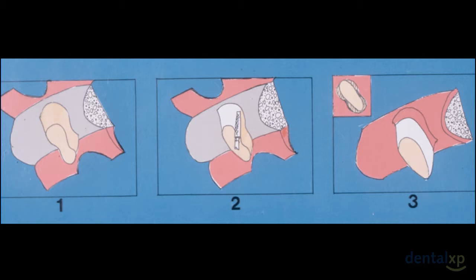When you look at the upper left picture, the dotted areas, the very light gray areas, are the areas where we would remove surface, and the real black area is the area that we would try to leave alone. Again, the goal is to shape line angles into the concavity, thus removing the concavity.